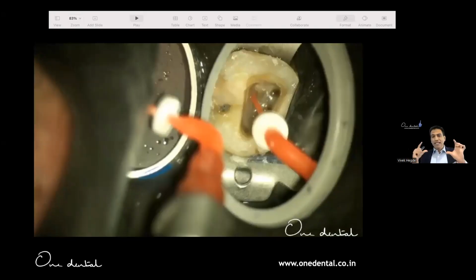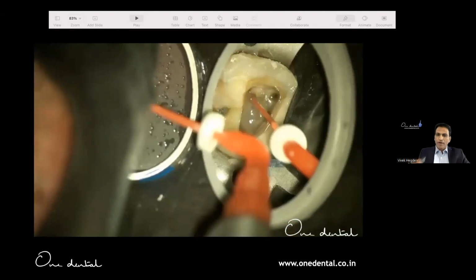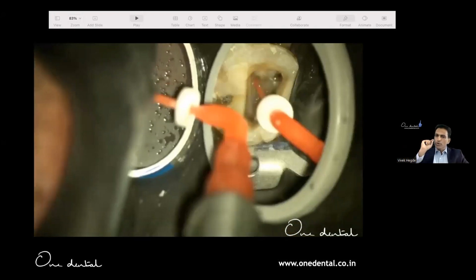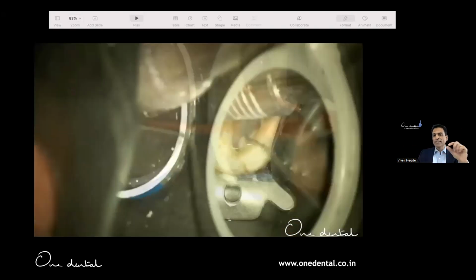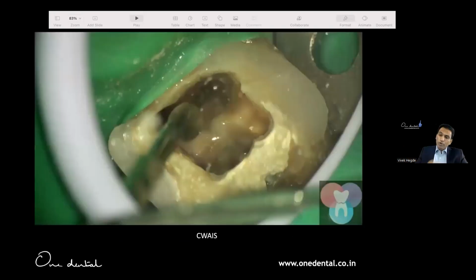We use compressed air. It's like a handpiece. It's got a plastic polymer tip. With the stopper, you're going in and out of the root canal system with the irrigation in place, and you're activating thoroughly. Have I used this? Of course. Today we have another system, a modified system of this.